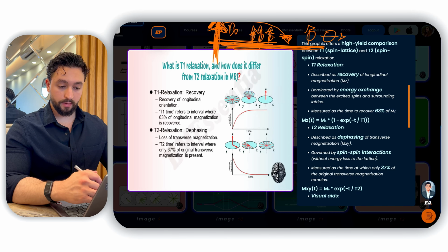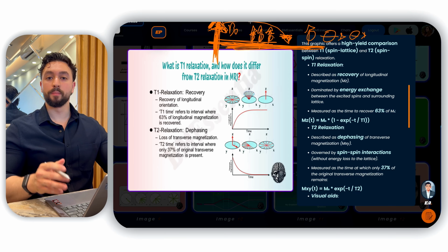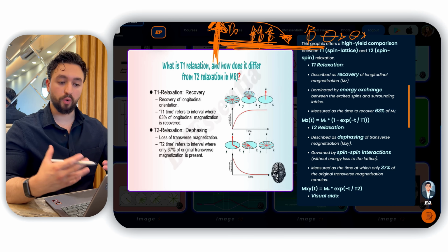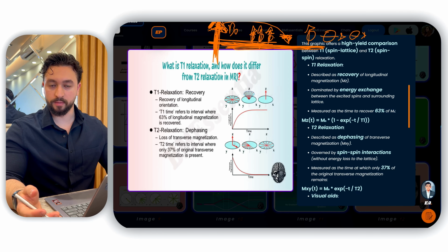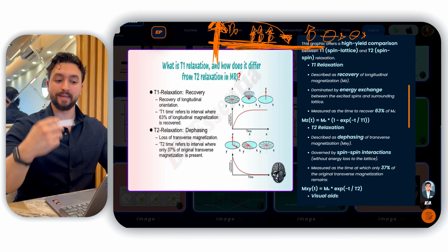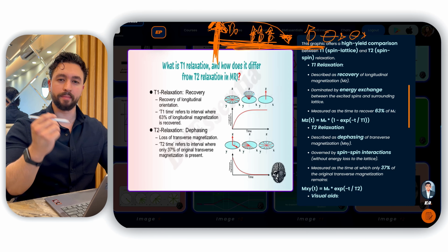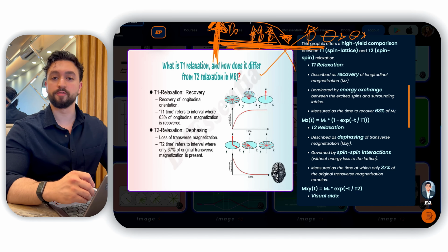And one more thing that will happen is that all of these proton spins will now become in phase. They will become homogeneous and they will all spin at the same precessional frequency. So they have been tipped over and then they start becoming homogeneous and all spinning in the same direction at the same exact speed. And then step 3 is that we cut the RF pulse off.